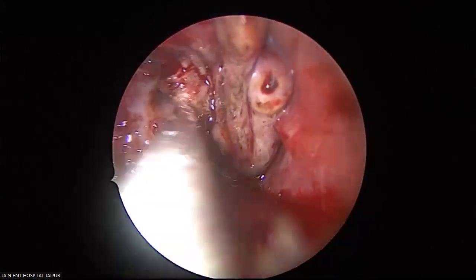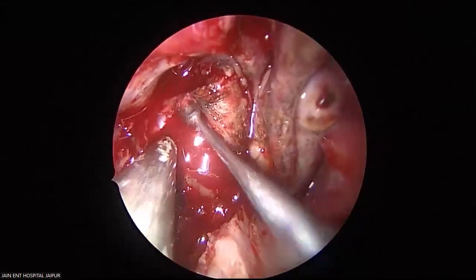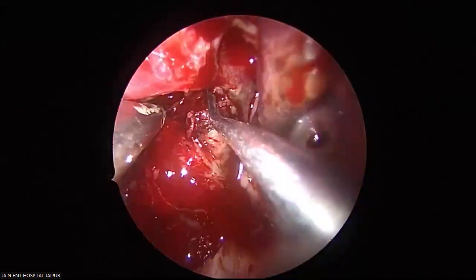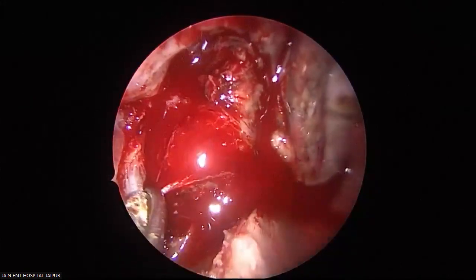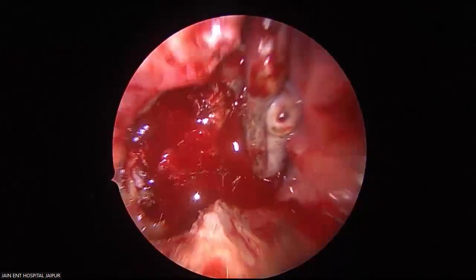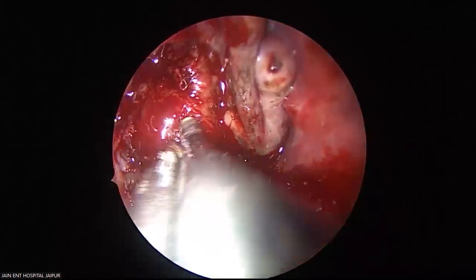I have incised the periosteum and separated, to enter into the pterygopalatine fossa. That is the fossa per se. Now we are on the tumor surface.